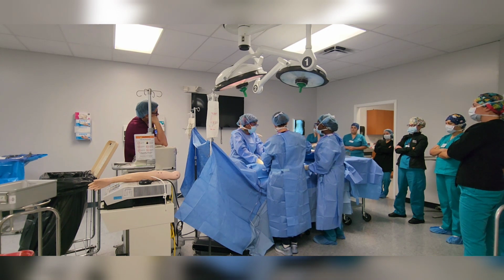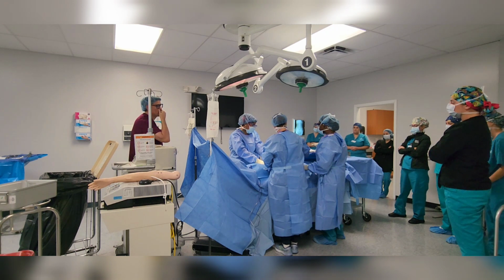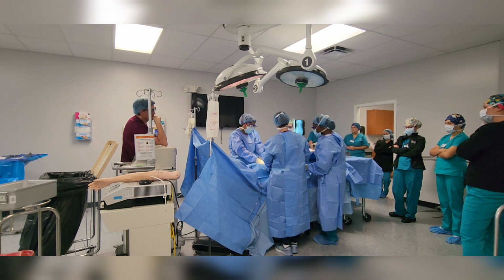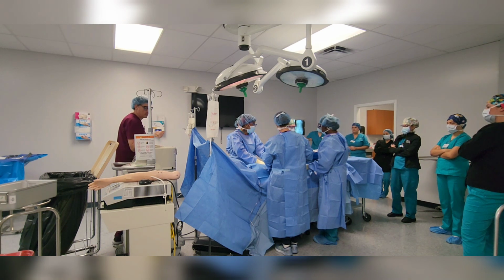Do you take it out of that thing or no? Yep, you can take it out. Now grab it with this hand and then lay it on the field. There. That way it's going to be in control. Okay? So if they're suturing, what is the next thing they're going to need? Scissors. Yep. Clamp, clamp, cut, tie.